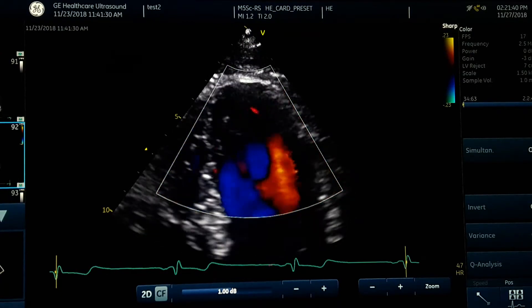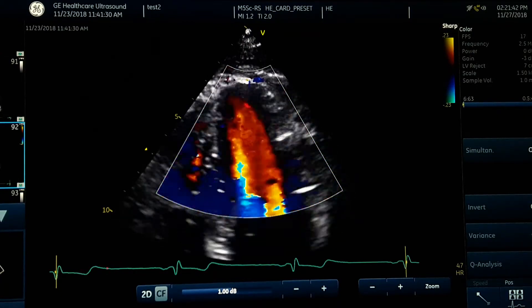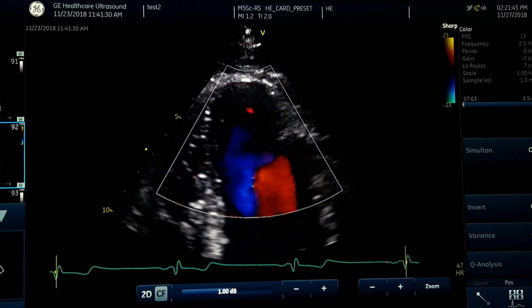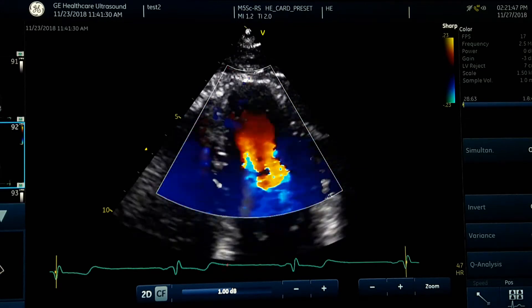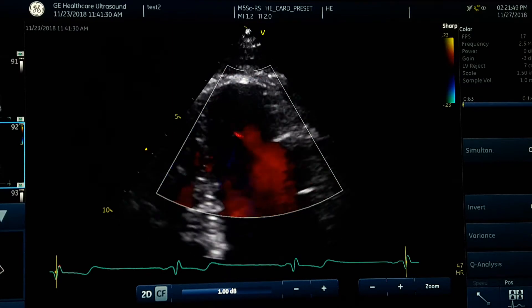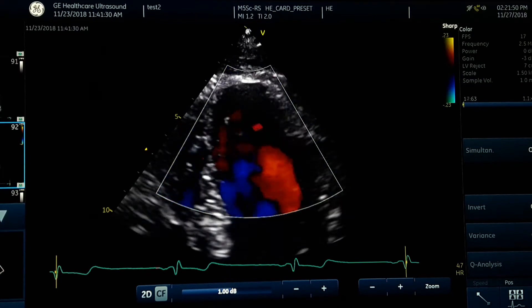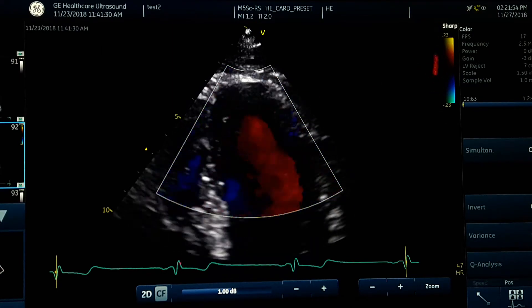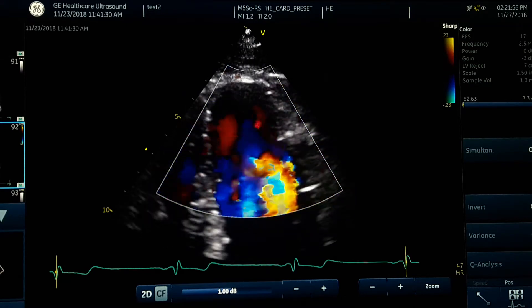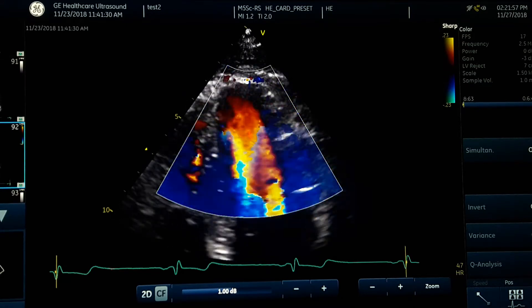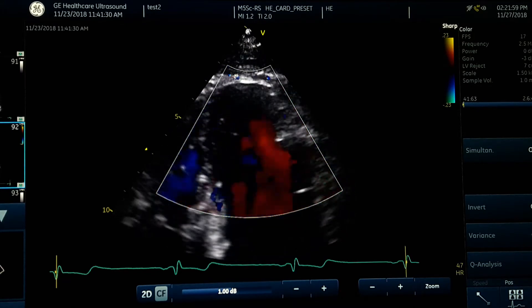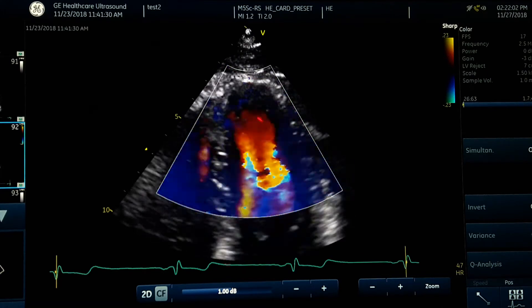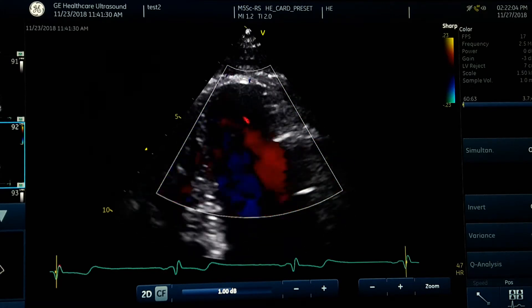With color Doppler, as you see here, color fills all the way to the apex. Sometimes, because the patient has a low ejection fraction, the velocity at the apex is low. You can decrease the scale — instead of 40–50 cm/s, bring it down to 30–35 or even below 30 — and see if the apex is filled with blood flow.